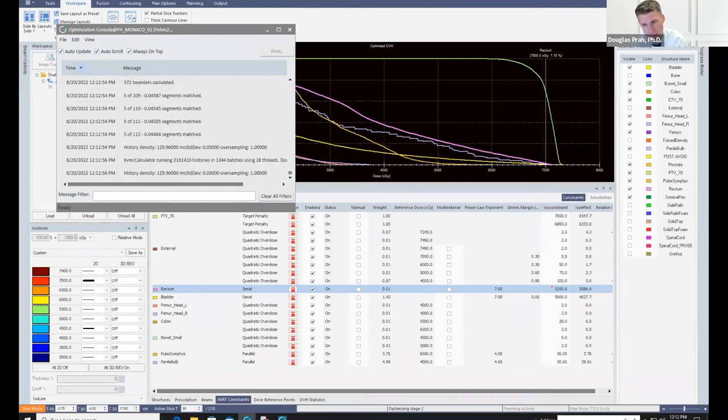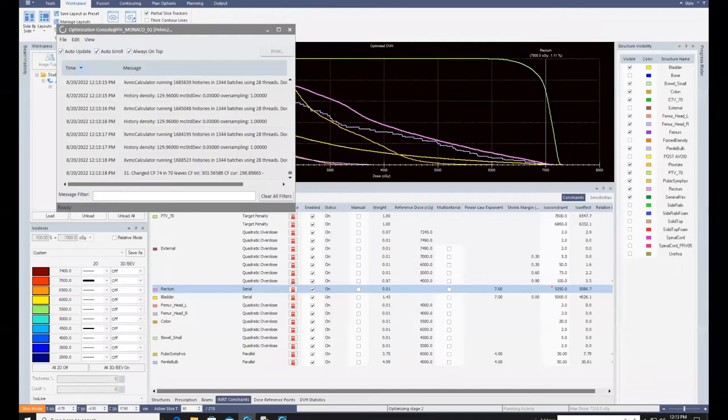In general, we tend to find slightly higher doses in air in comparison to some of the other algorithms. So with the other algorithms, it might look like you're achieving the constraint, but in reality, if you were to recalculate it using Monte Carlo, that lower dose line is probably spread out a little. It's probably larger than what's being reported by the planning system. So it's something to keep in mind. I apologize, this is taking quite some time to go here.